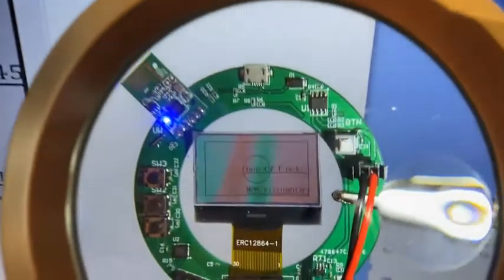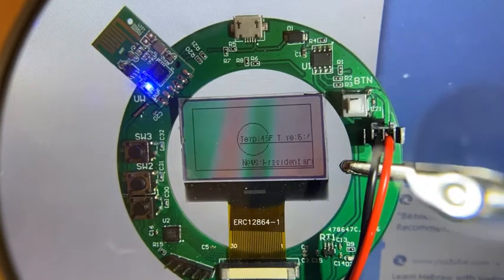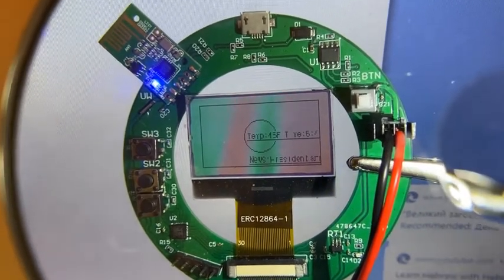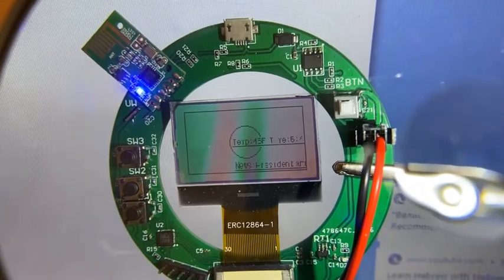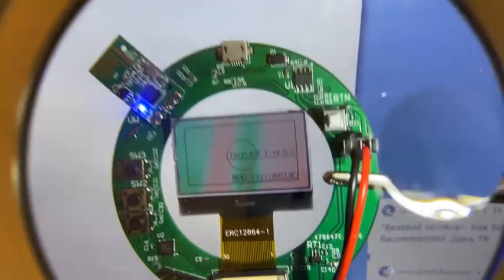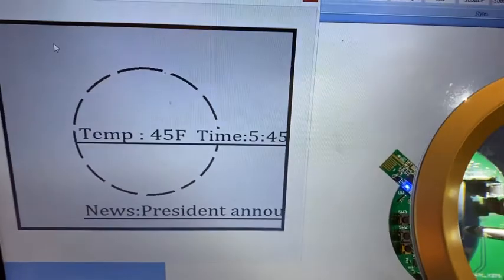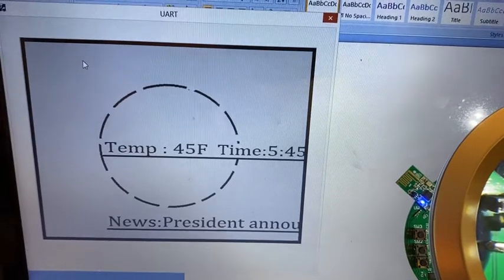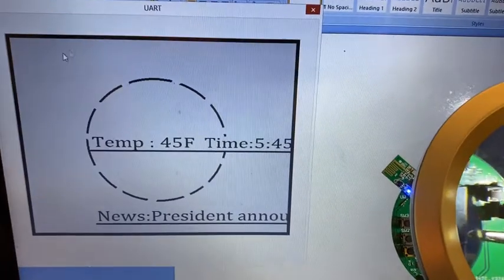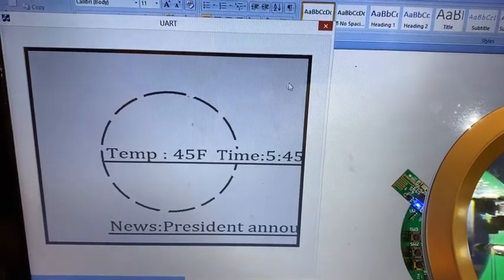So let's see how the contact lens display reacted. What happened is that temp 45 came in focus within the dashed line section of the display. And the image shifted proportionately and in the direction diametrically opposed to the direction of attempted accommodation and refocus.